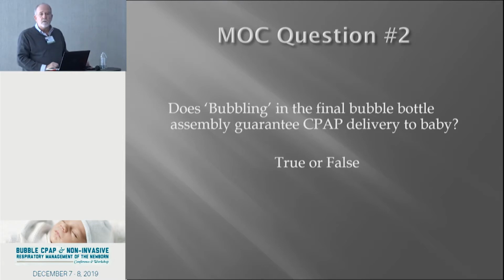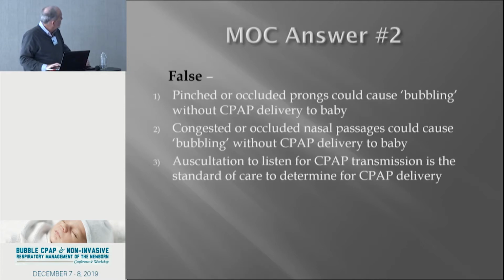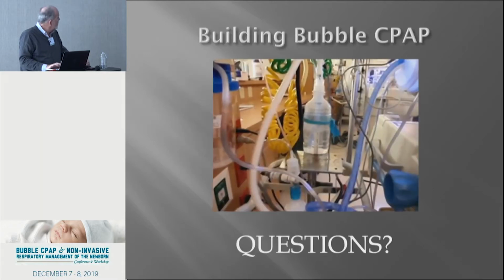As long as your baby's on 21%, you come up with a standard that says, we will try to wean, but if we need to raise the FiO2, we didn't gain anything, we go back. Because we're not going to deliver a possibly damaging drug if we don't have to. Okay? Can't say that enough. I was like in the back going, yes. Okay. And that was false, and those are reasons why it might not be getting there.